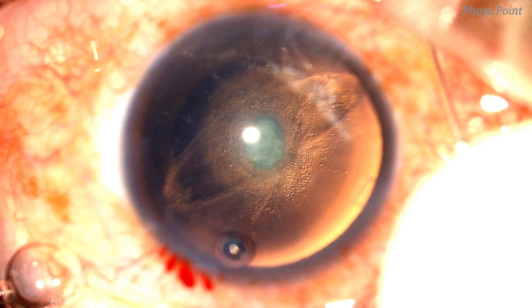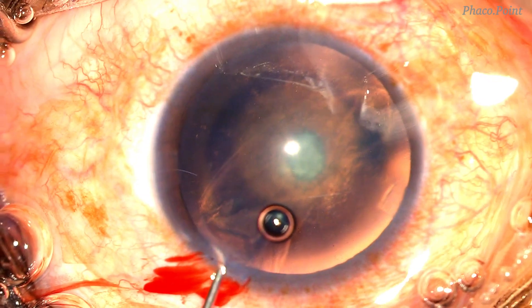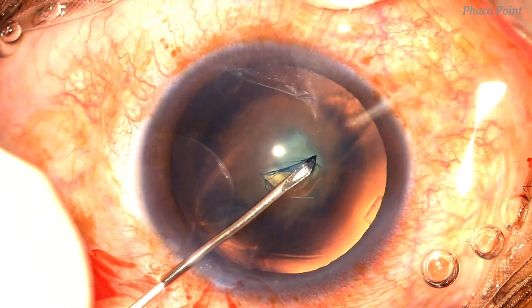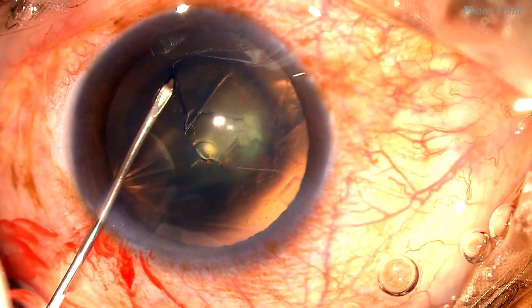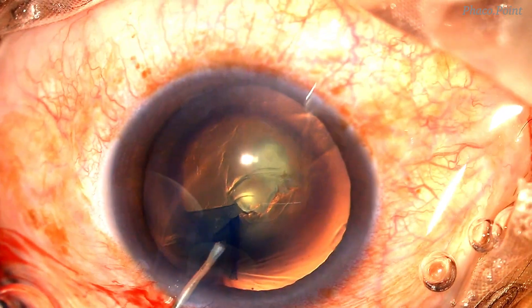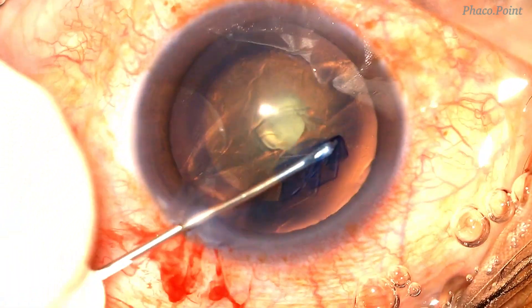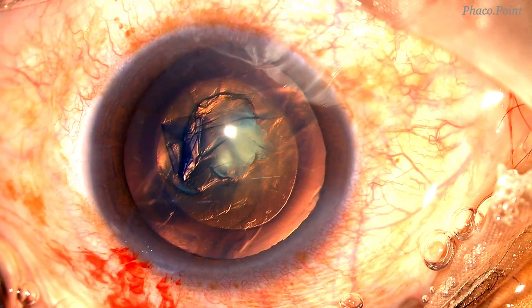Being a case as challenging as this, we want limited room for error. It's important to ensure that the cystotome is perfectly made, as a faulty tip is known to create an erratic rhexis. Knowing that there's a good possibility of needing to place a three-piece IOL in the sulcus, we aim for a rhexis of about 5 to 5.5 mm to provide adequate anterior capsular support. And as you can see, this is what we've achieved — a well-centred 5.5 mm rhexis.